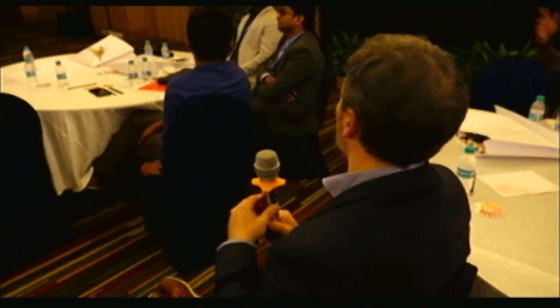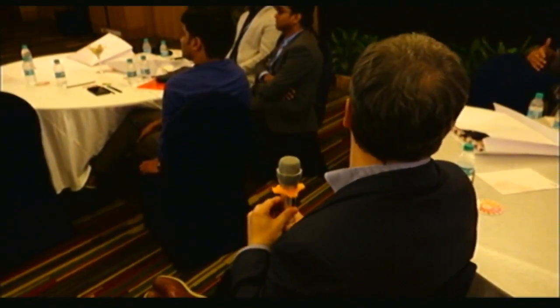But no, the first case had CNVM. Yeah, the first case had a CNVM. What sir is telling is that if you have the dome-shaped macula with just the fluid, with no demonstrable CNVM either on OCT or on FFA, then we are wasting our time trying to treat these patients. Yeah. And it responded to a certain point, because that's the fluid that got rid of with the injection, but the rest is due to the dome-shaped macula. It's a very, very good case. Very good. Congratulations.